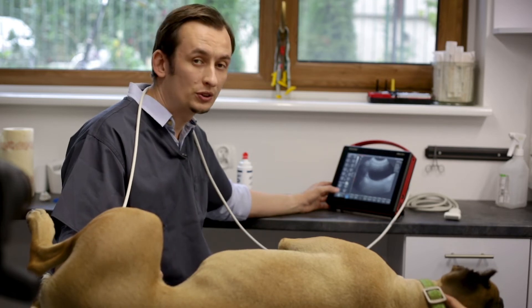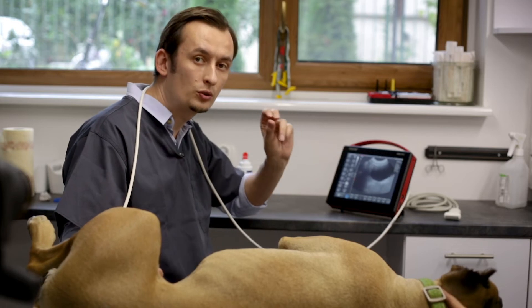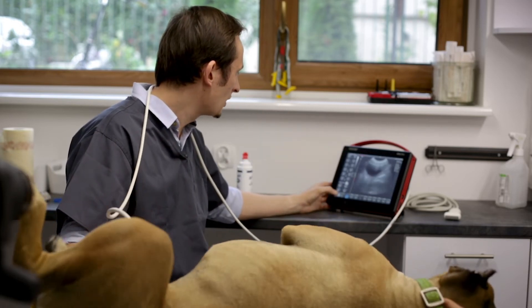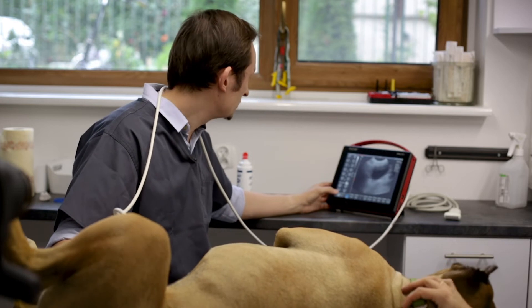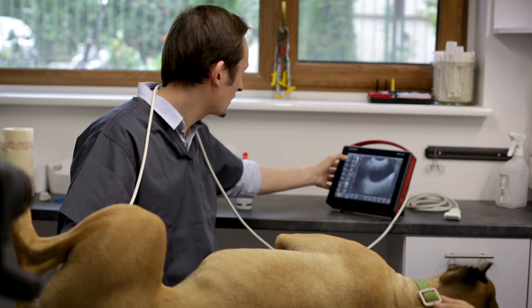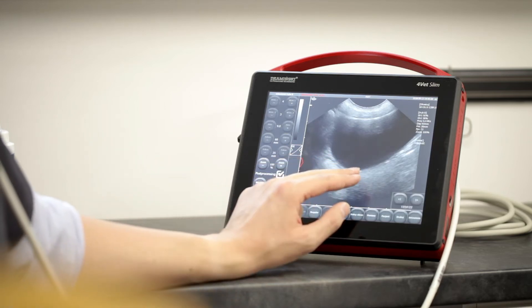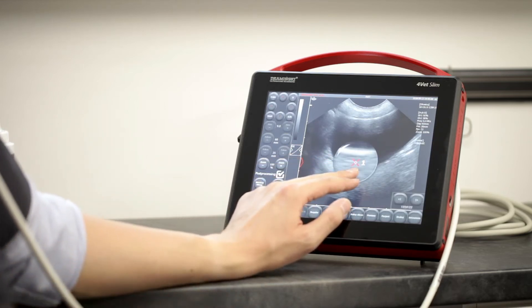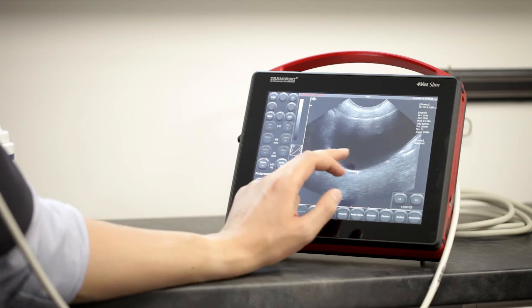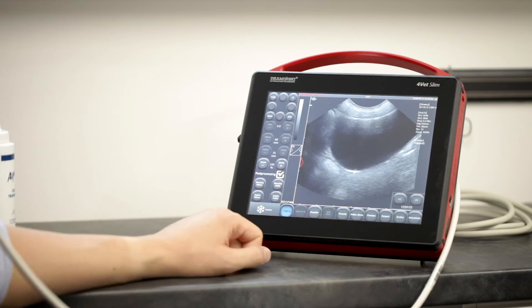Now I will show you how to measure some structures on an ultrasound image. For example, we can measure the wall of the urinary bladder. Here we can see the very thin two hyperechoic layers of the urinary bladder wall. If I want to measure something very small, I just press and hold my finger on the screen — and this is it, 1.5 millimeters, so very good.